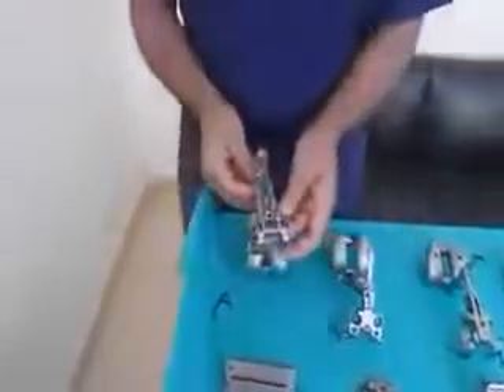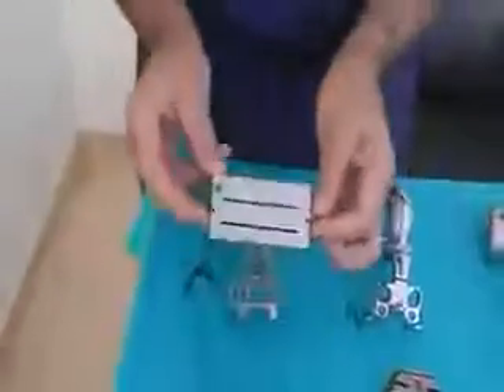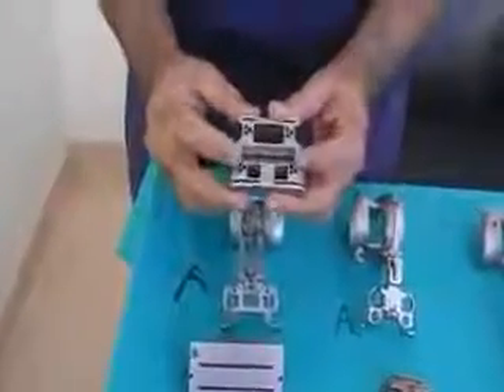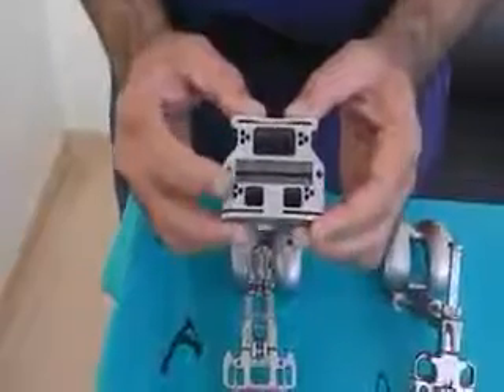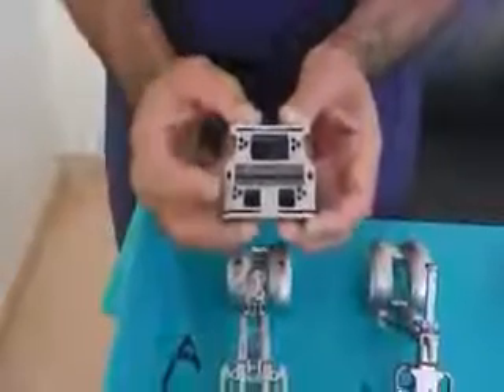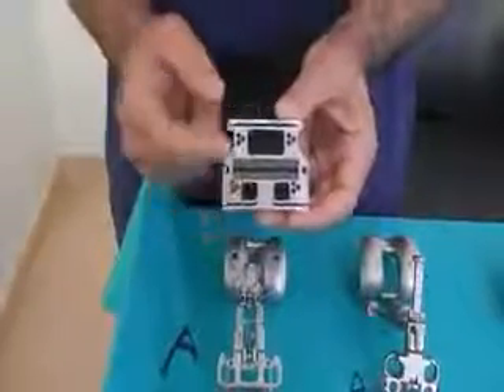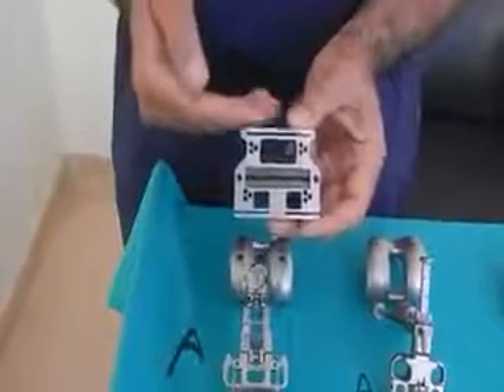The reference system is posterior. Essentially what that means is that this arm will move and size your femur, and you will put your pins based on the posterior condyles. Now if you downsize based on these two reference pins, you are tending to notch. We now have better instruments with plus two minus two on the AP cutting jig. This allows you to titrate your flexion gap without notching anteriorly or becoming proud anteriorly.